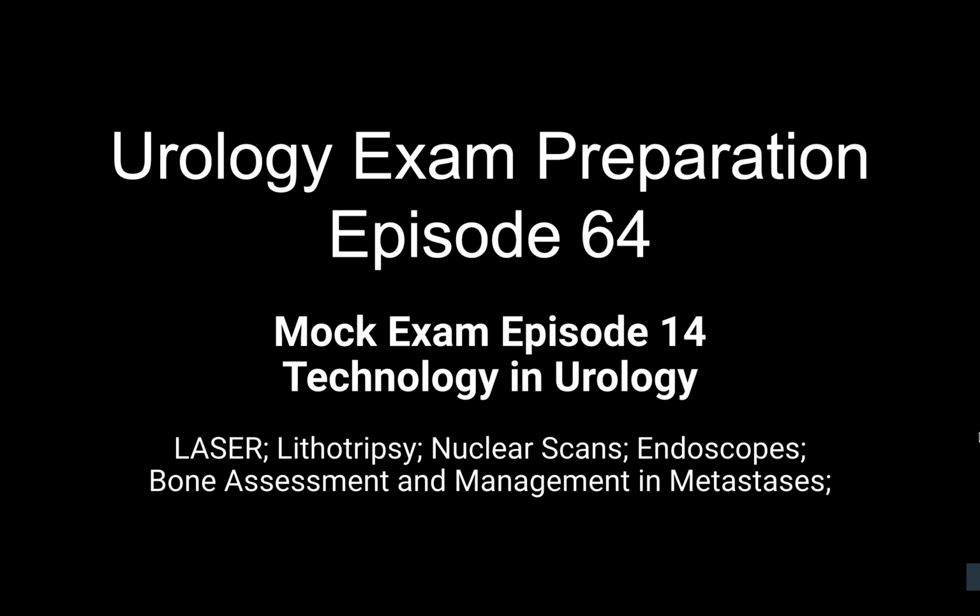But otherwise, you need to really book a slot in the endoscopy room, which may already have a session running. So there are some advantages of these single-use scopes, which can be widely used on various clinical floors compared to only the endoscopy rooms. The cost is the issue.